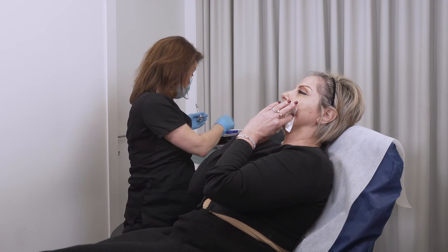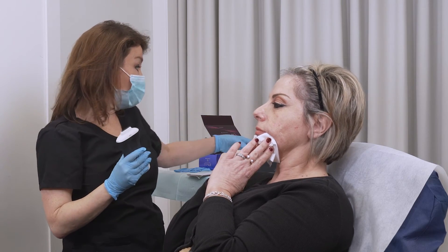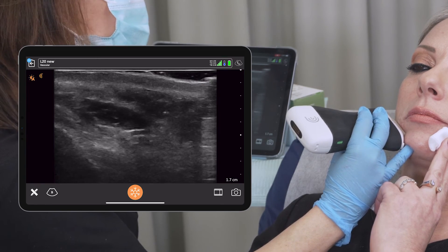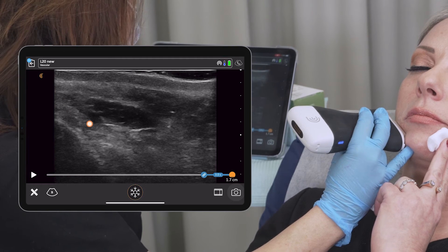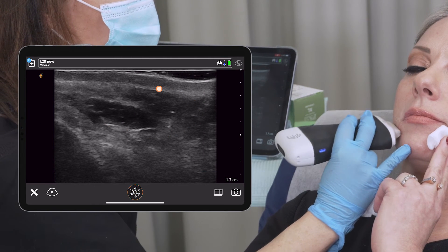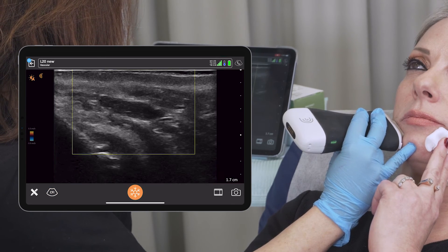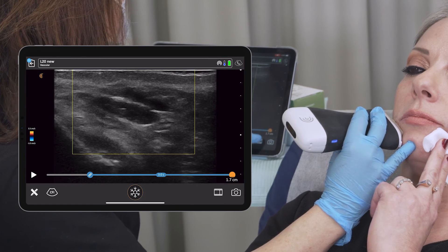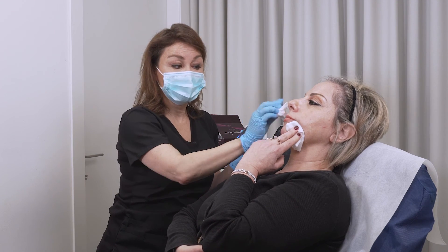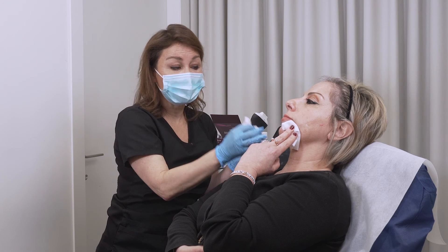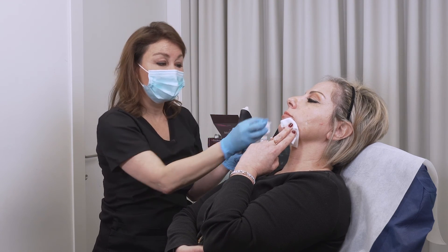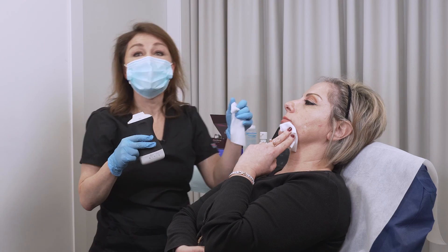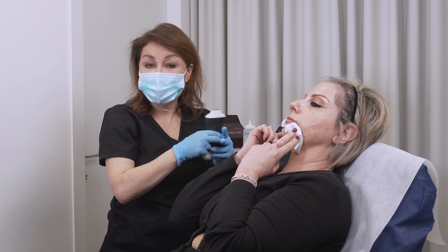We can now check the placement of the filler — whether it's placed as intended. The hyaluronic acid is visible here in the marionette line area. I can check the vessels and confirm they are still pumping well. We injected into the marionette line without obstructing or hitting any vessel. There is no hematoma, because we injected away from the area where the larger vessels are.